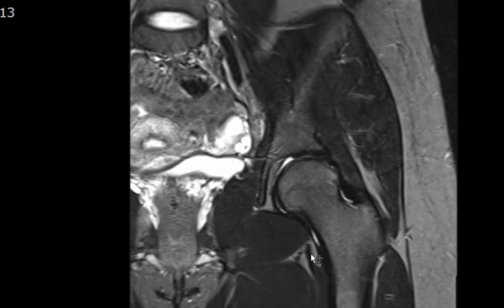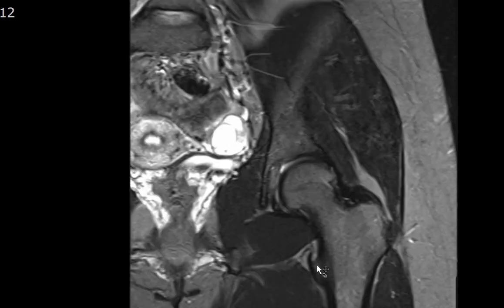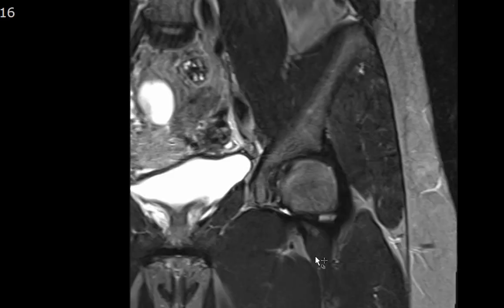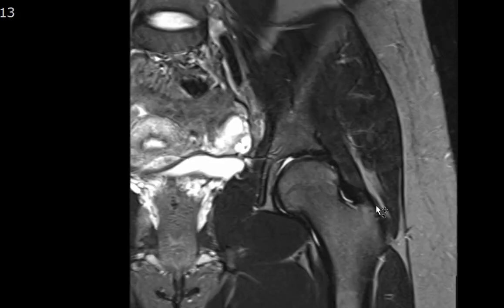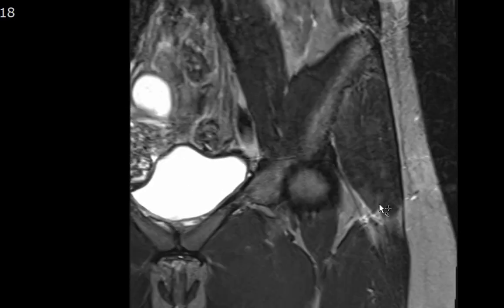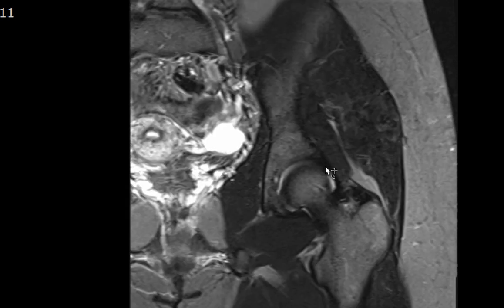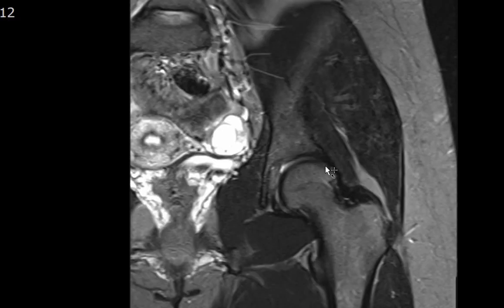The iliopsoas tendon inserts onto the lesser trochanter — this hypointense structure right here. Avulsion of the iliopsoas tendon off the lesser trochanter in an adult is pathologic until proven otherwise, as it usually heralds the presence of a malignancy. The gluteal tendons — gluteus medius and minimus — insert onto the greater trochanter. The labrum is this fibrocartilaginous structure seen here.